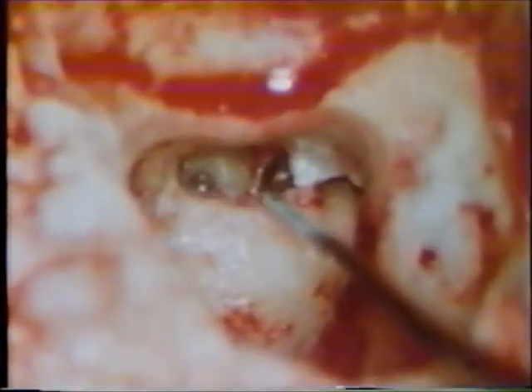A post-auricular incision has been made, and the mastoid has been removed along with the opening of the facial recess. You see the facial nerve, head of the stapes, and the round window niche.